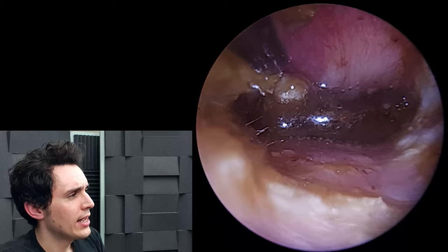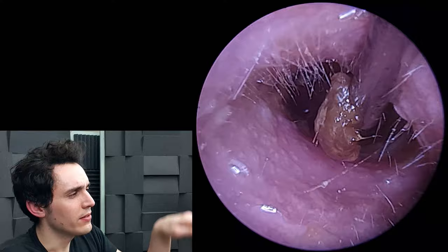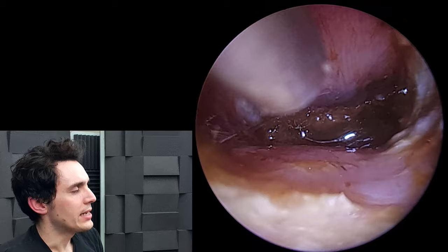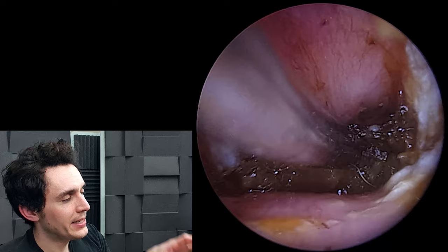What you're seeing here is an iceberg situation — this dark wax right at the back is obscuring most of the eardrum. It was very difficult to get this last piece primarily because it just wasn't ready to come out, and access was very difficult, partially due to the swelling.